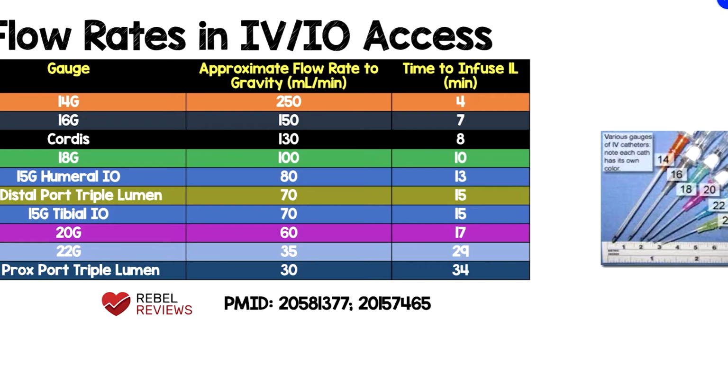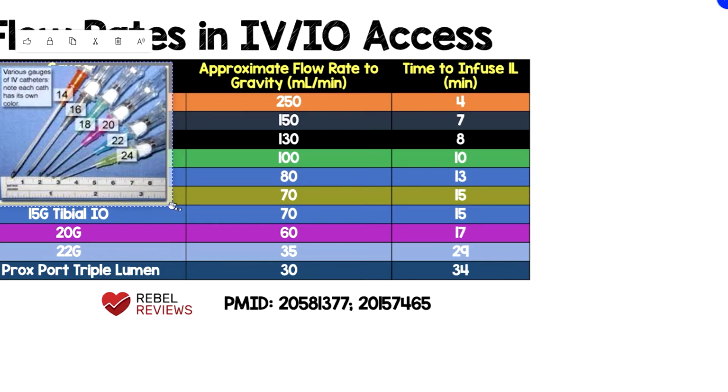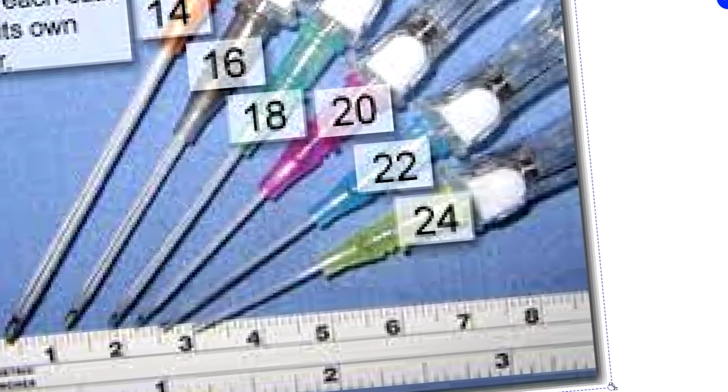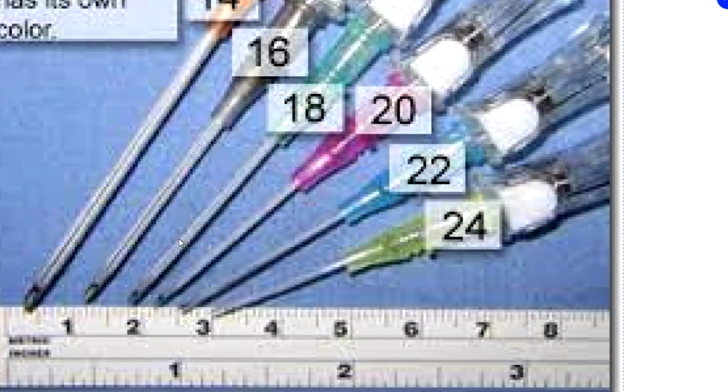Okay, and so just to continue on this theme, when we're looking at angiocatheter or IV catheter sizes versus needs. So when we're going to need a 16 gauge versus a 24 gauge. And so, it's about volume. And let me make these a little bit bigger here, so that maybe we can see the diameter.